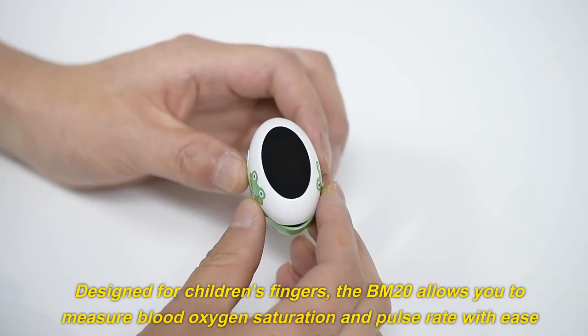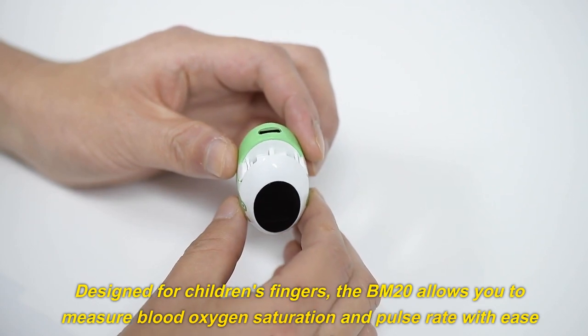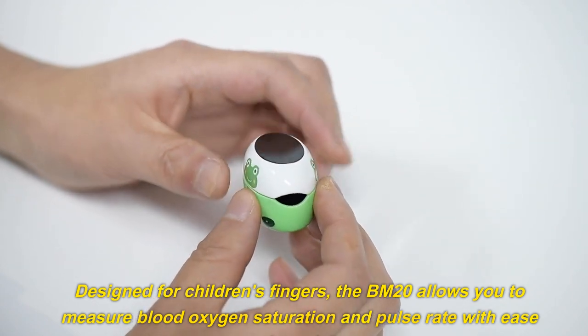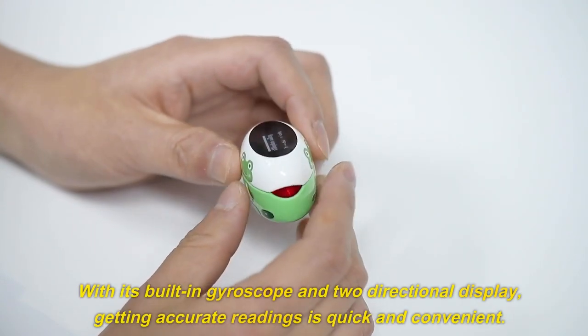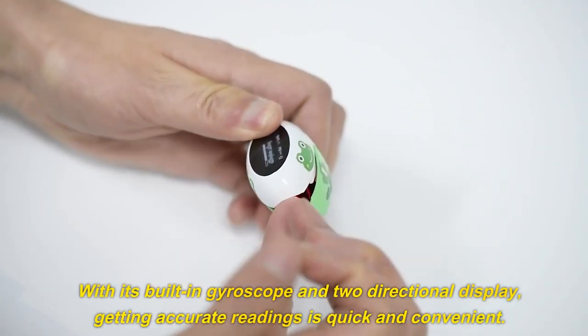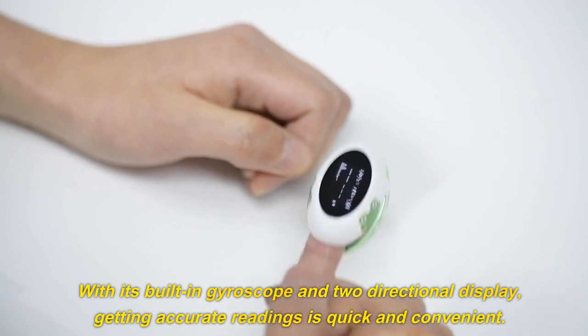Designed for children's fingers, the BM20 allows you to measure blood oxygen saturation and pulse rate with ease and precision. With its built-in gyroscope and two-directional display, getting accurate readings is quick and convenient.